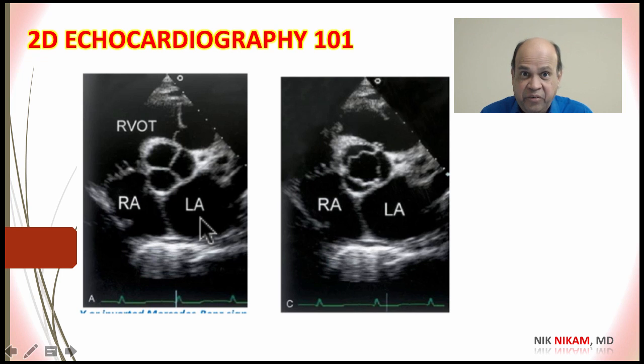Now we are into a real echocardiogram from anatomic structures. Here we have the left coronary cusp, the non-coronary cusp, and the right coronary cusp. Here we have the right atrium, the tricuspid valve, the right ventricular outflow tract, and the pulmonic valve.